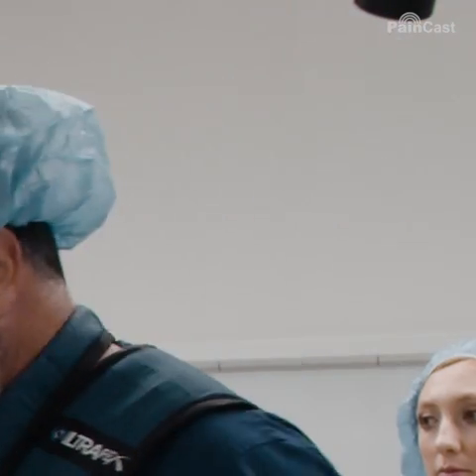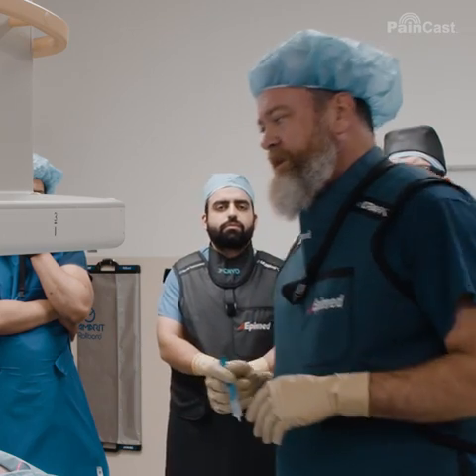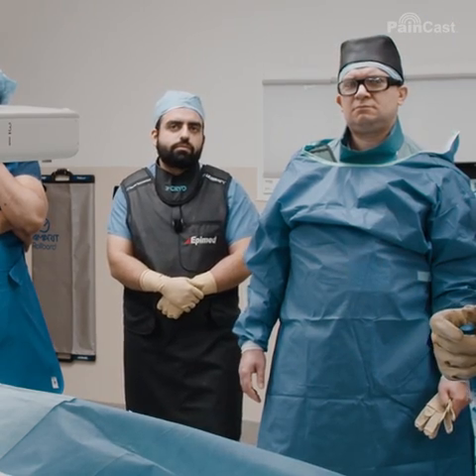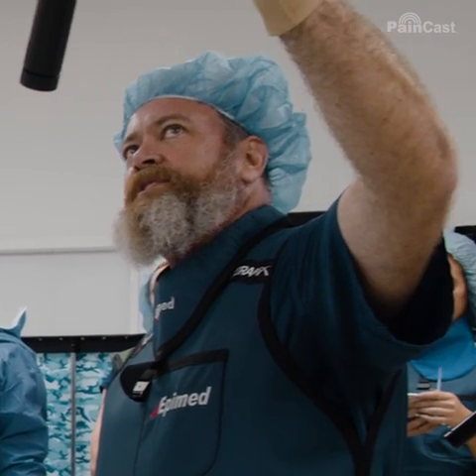So we'll go back the other way towards the head. We've gone a little bit deeper, and I think you can appreciate, just even in the AP view, the depth here. The one before where it was a little bit further back, it kind of was sitting on the edge.